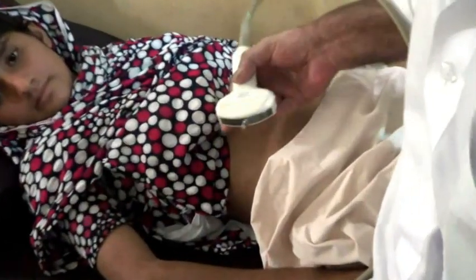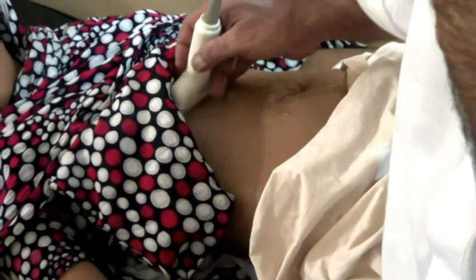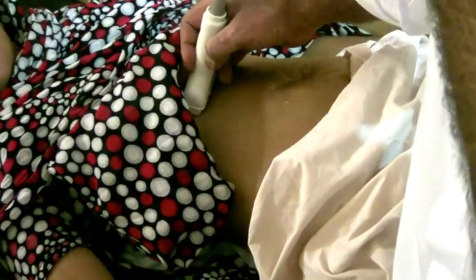We are going to scan a 14-year-old girl with the only complaint of pain in the abdomen, constant for a few months, with no clinical examination notes, no history of the patient, and no lab investigations.